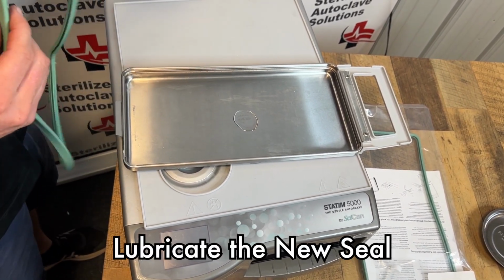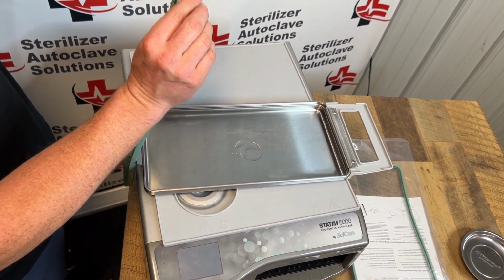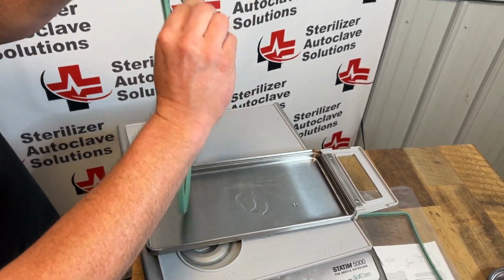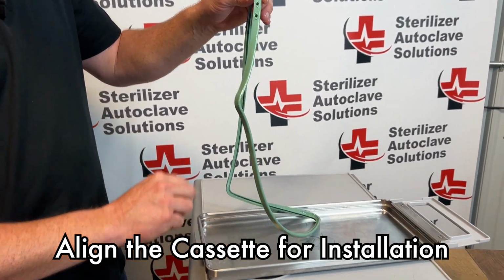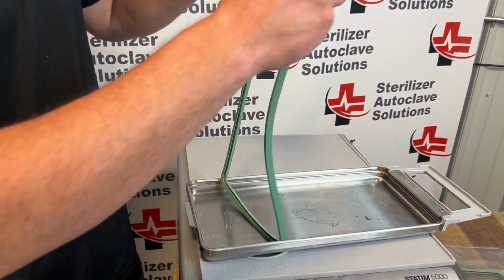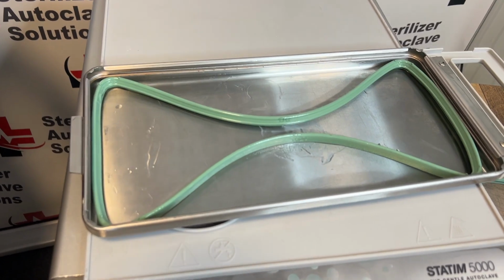Next, what I'm going to do is take my new seal, and I'm going to dip a couple of fingers into that lubricant, and I'm just going to go all the way around the seal. On this seal, you will notice there are 2 holes. We're going to align that with the back of the cassette. I'm going to take this with the nubs facing up and just gently place this on the inside like so.